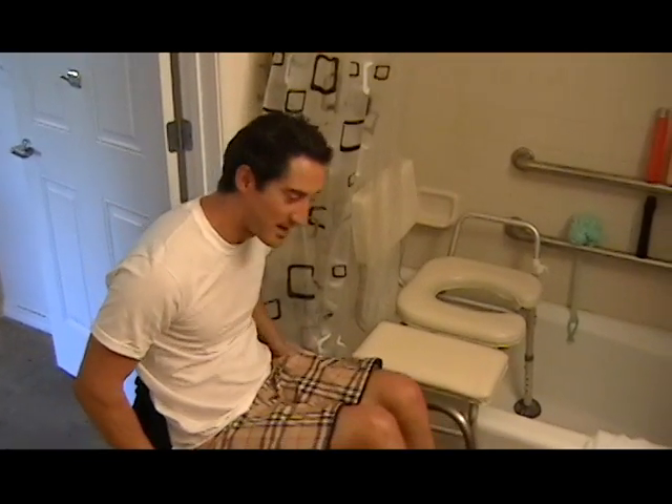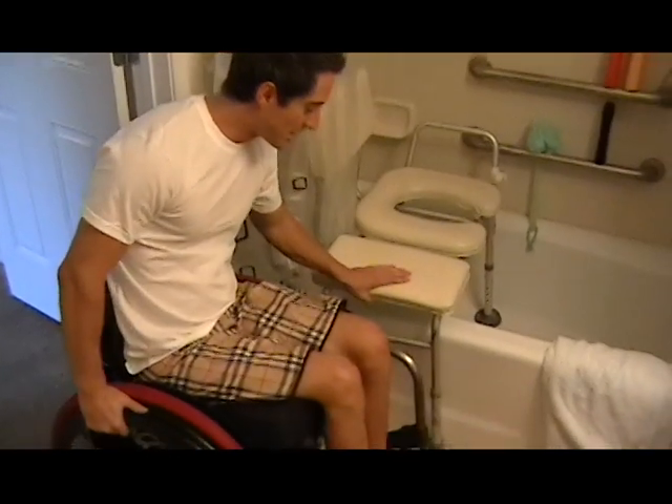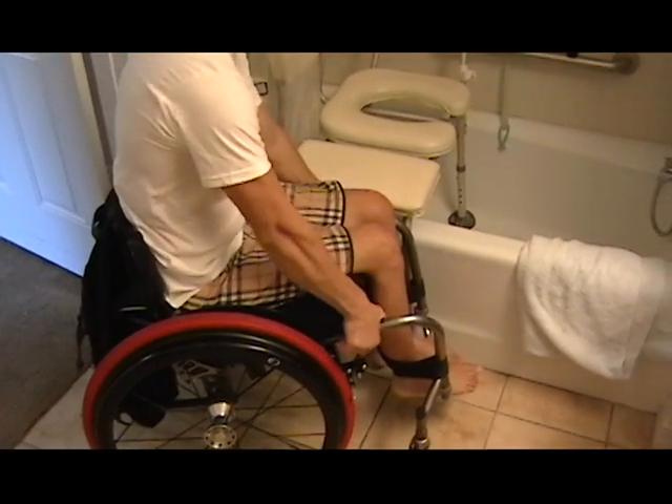Hi guys, so today I'll demonstrate how to get in the shower. I usually come at an angle like this, close to the shower bench, and lock the wheels.